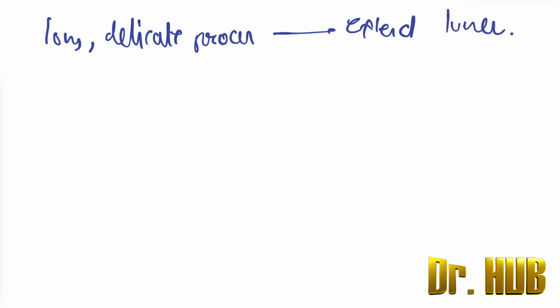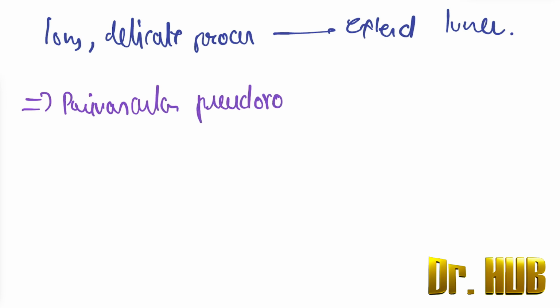Next, we will look at the perivascular pseudorosettes. What do we mean by this?